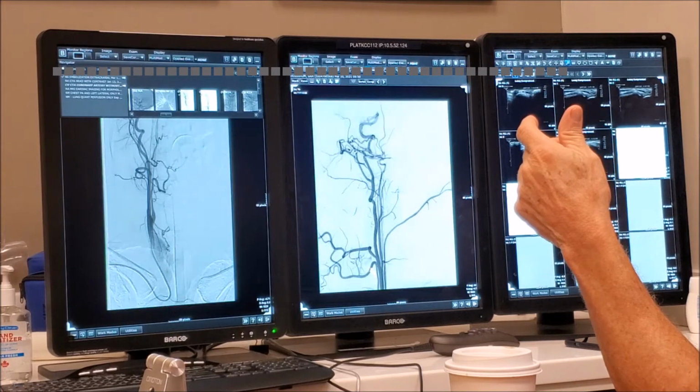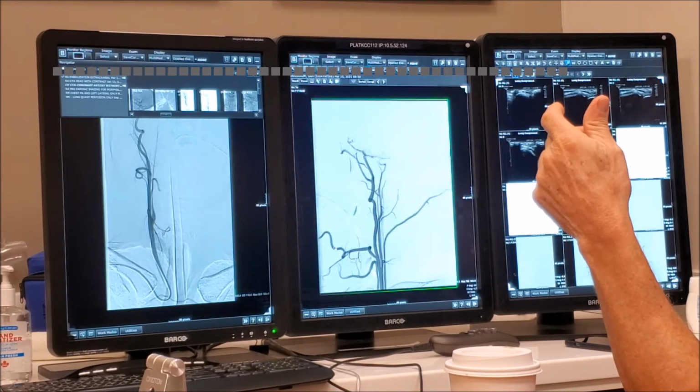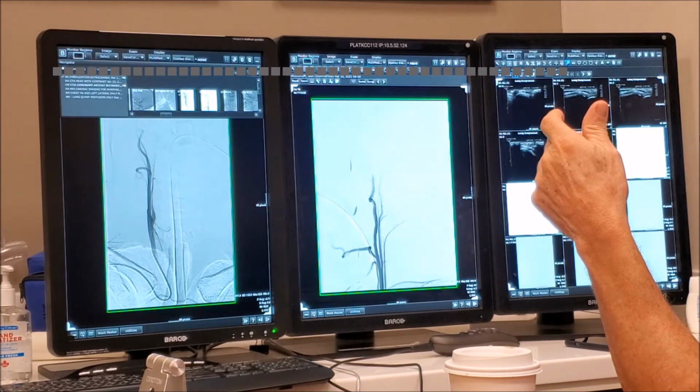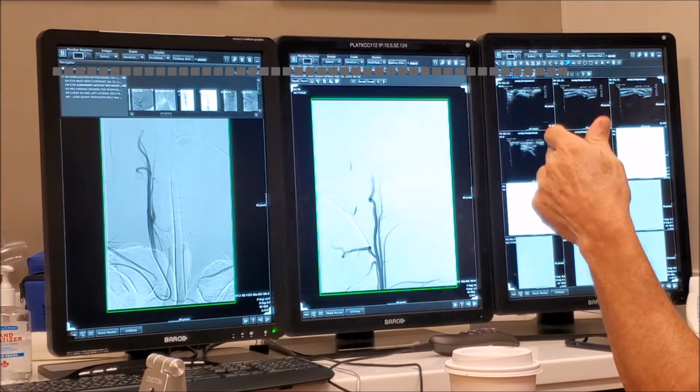Let me go. Okay, so this is lingual. This goes to the tongue. That's it, but very low origin. So now we're going to have to figure out what is what. There is a vessel back here. See this teeny weeny one? Probably ascending pharyngeal. It's the ascending pharyngeal.